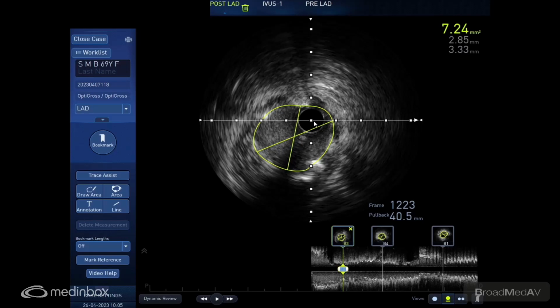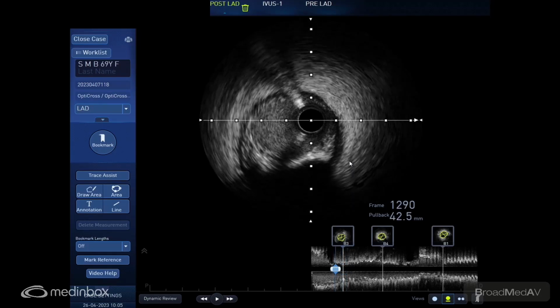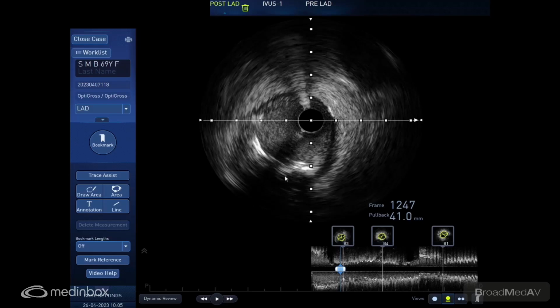Just a 3.5 balloon with a nominal pressure. So we'll just do a 3.5 for the proximal because we feel it can be done a bit better. And then we are done with the whole thing. 3.5 balloon, please. Short one. Short balloon, please. 8 or 10.